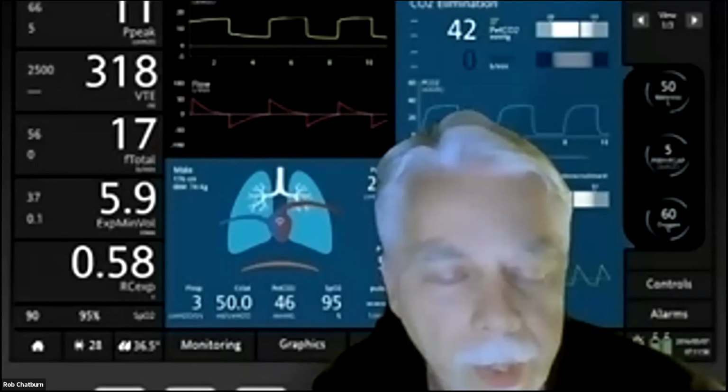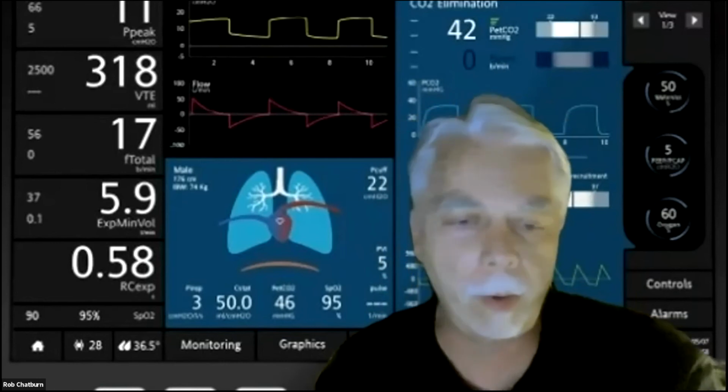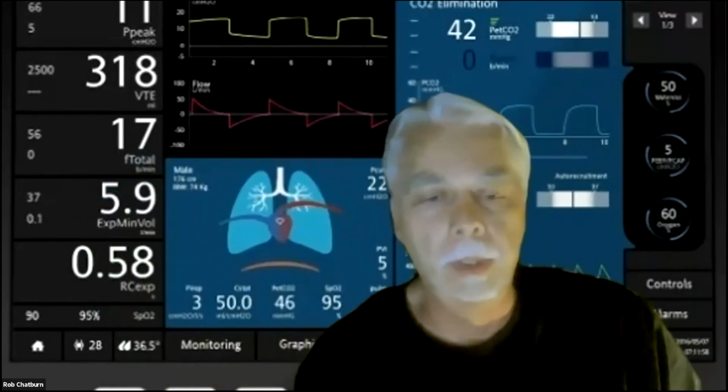And that lower delta P is going to cause artifactually your mechanical power to be elevated based on this equation. So that conflation may be possibly playing a role in some of the outcomes here in the study. Yeah, and the other thing is that was just a very simple approximation for power, and it may not have been the best model for calculating power under those ventilator circumstances.